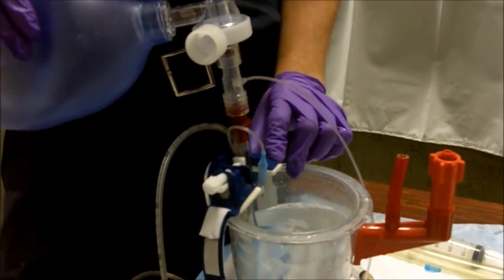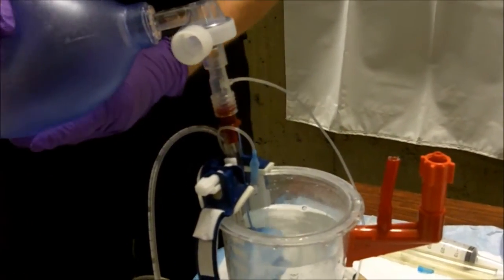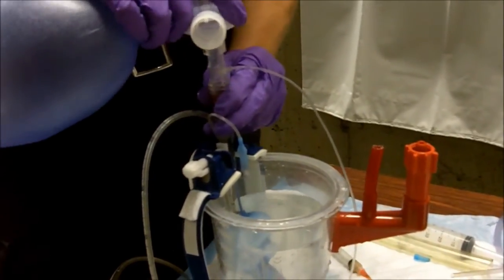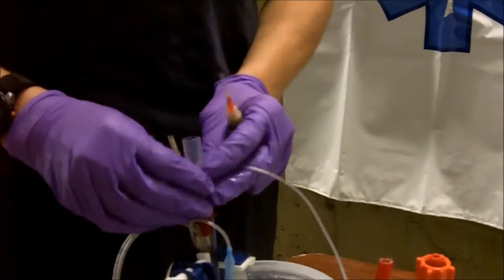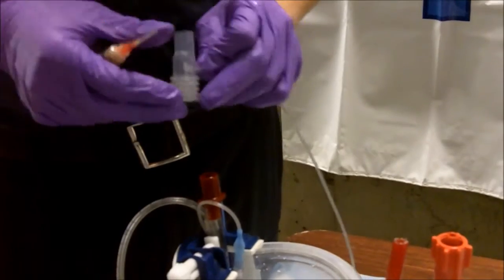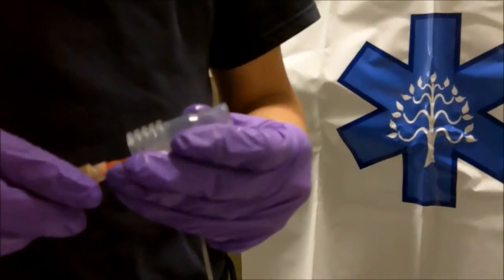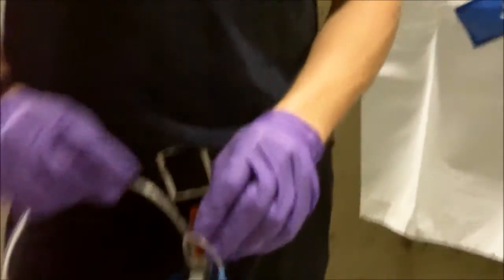You'll see that we're using our very low-pressure bag squeezings for ventilations over one to two seconds, allowing appropriate exhalation time. Mind you, my rate is accelerated compared to what would be happening during a cardiac arrest event. But I also want to include that just because your blind insertion airway device, our King airway, is inserted, doesn't mean that aggressive ventilations won't cause additional gastric distension and possible aspiration. If the patient manages to vomit around the distal cuff of the King airway, and it goes unrecognized, you'll be ventilating the patient with stomach contents, causing an aspiration. If at any time that vomitus were to touch this device here, you can see an occluded end-tidal CO2 sensor. This has rendered this device inoperable. So protect your end-tidal CO2 by removing it in the event of vomitus, and do what you can for suctioning.